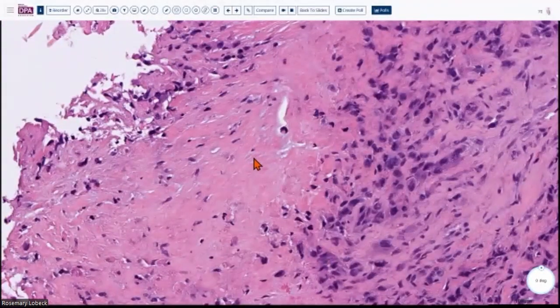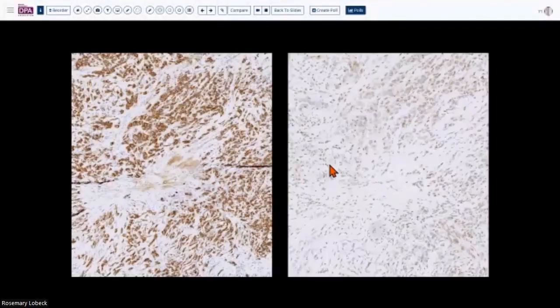But our residents know what I'm talking about here. This is EMA, and cytokeratin is going to show you the same pattern, right? So this is the necrobiotic area, and then all the tumor cells are diffusely strongly positive for EMA. And this is INI1, and you can see all the tumor cells, the nuclei have lost INI1. So this is a case of epithelioid sarcoma that mimics granulomas, and it can be very small and nondescript as well.